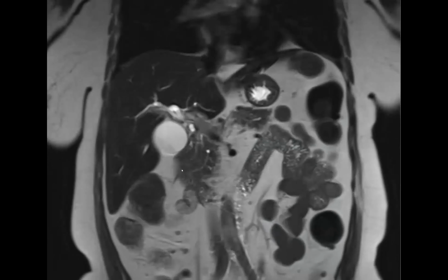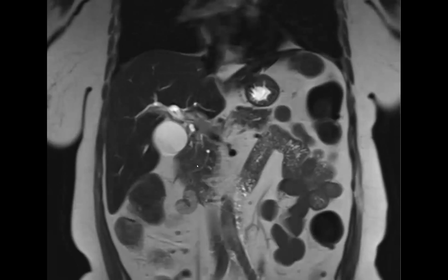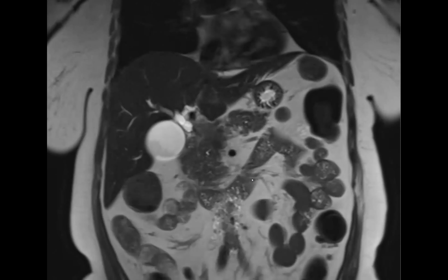So what do you guys think this is? Is it like we are looking at the Klatskin tumor, which compresses over the hilum? Exactly. So we've got biliary obstruction, abrupt truncation, and we've got this mass here, about a 2 centimeter mass. It was not obstructing the lower CBD, and the pancreatic duct was okay. Theoretically, I guess it could be arising from the upper pancreatic head, but it's essentially a Klatskin tumor causing obstruction here.